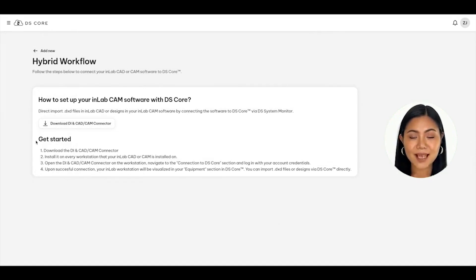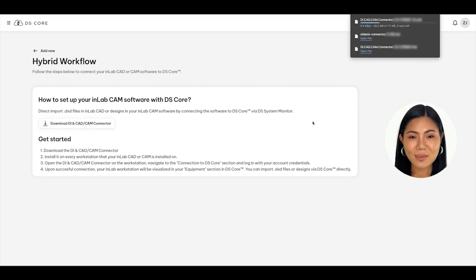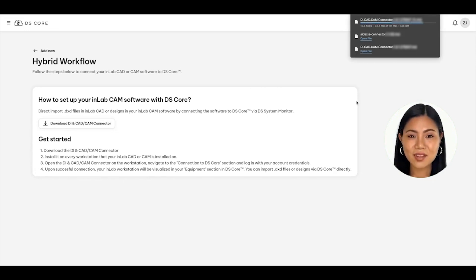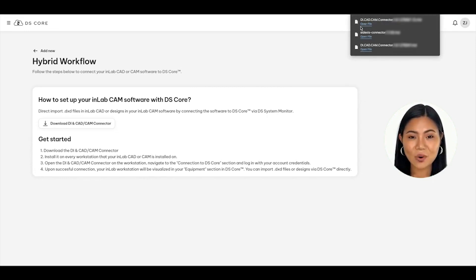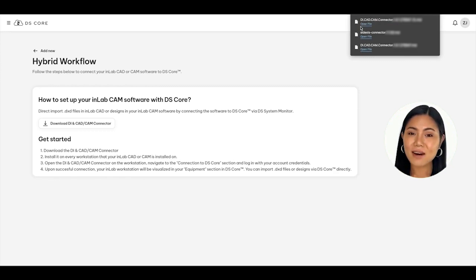To download the connector in Step 1, simply click on the white Download DI and CAD/CAM connector button to start the process. Navigate to your download folder to open the downloaded connector file, log in with your DSCore username and password, and follow the remaining steps. Once your installation has completed, log in to the connector with your DSCore credentials to activate the connection. Repeat this process on any other computer running InLabCAD 22 or InLabCAM 22 software.